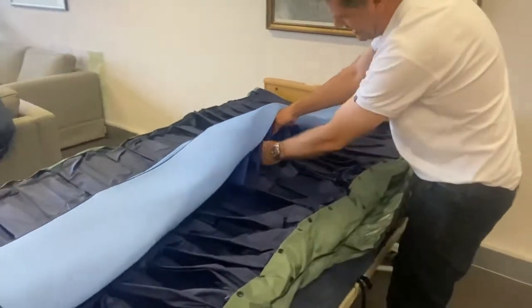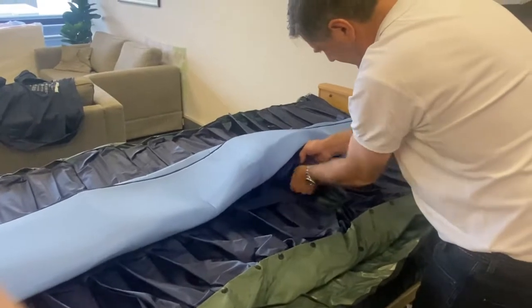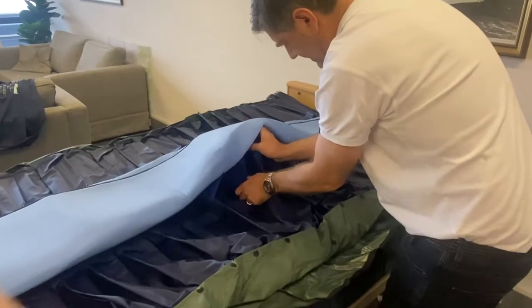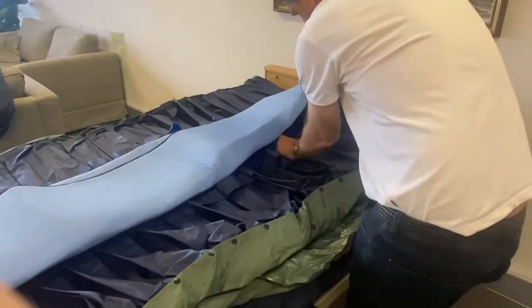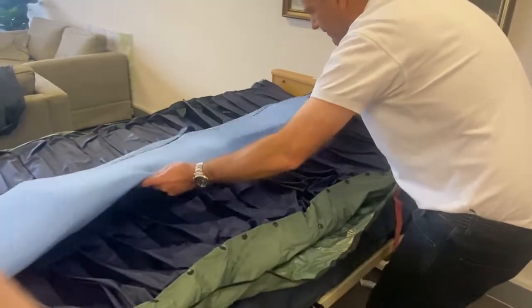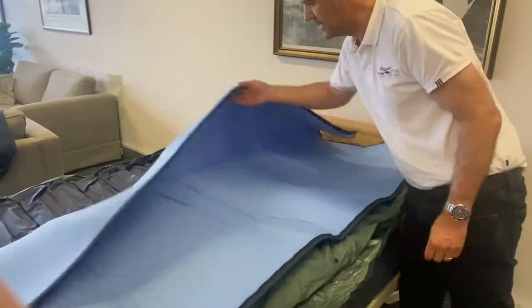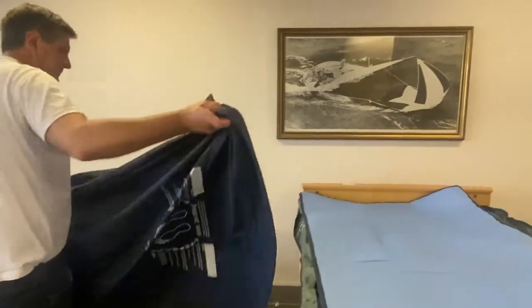You can see here that some are folded back on themselves as a result of feeding the cell through. So you just make sure that all the folds are neat and there's no folding over. And so when the cells are inflated, there's no excessive tensioning between the cells and the cell loops because it's a very neat fit once the cells are inflated. So now that's finished, you just unfold the coverlet. We put the top cover back on.